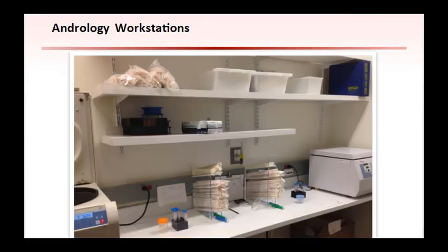In order to avoid any errors in processing sperm, samples should be processed separately in time or space. This image shows a physical separation between sperm samples. Each sample is processed on a different part of the bench and in a separate centrifuge. The sample container, tubes, and processing documents are all labeled with the patient's name and date of birth, and all of these are checked by 2 different andrologists. Other ways of minimizing the risk of cross-contamination include processing sperm 1 sample at a time. This can work for smaller labs, or processing samples in different hoods.